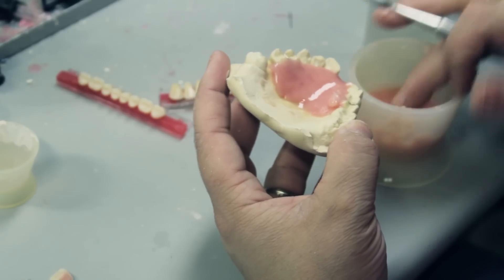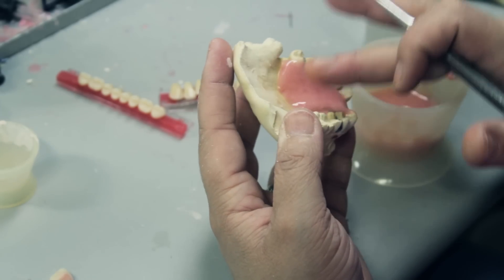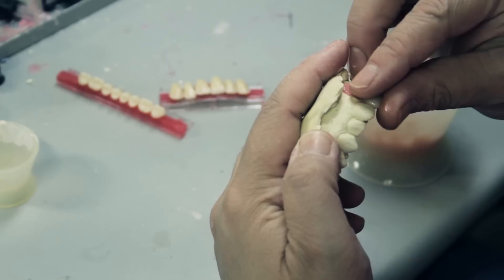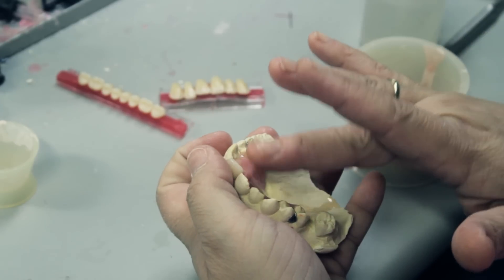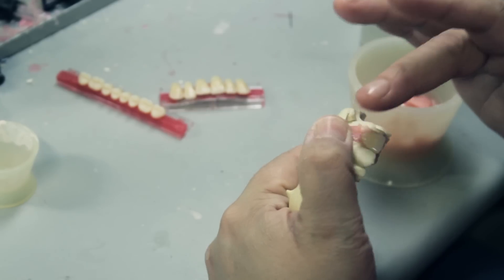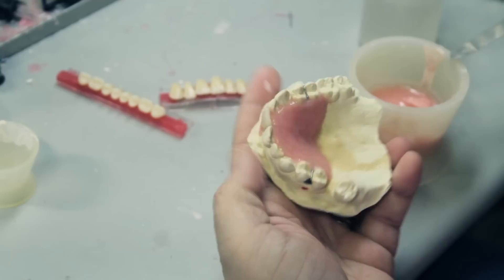I continue to smooth the acrylic with monomer. I will now place my tooth, making sure that the acrylic has surrounded the tooth to embed it, making sure that there are no bubbles, no rough spots, nothing sticking out. It looks like what's already in the mouth — you tend to not know that there is a false appliance in someone's mouth.